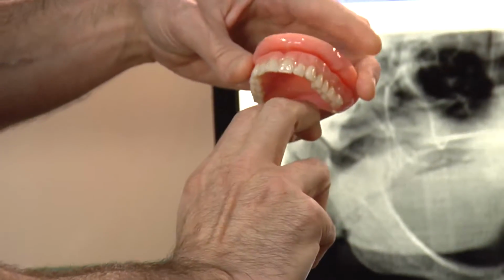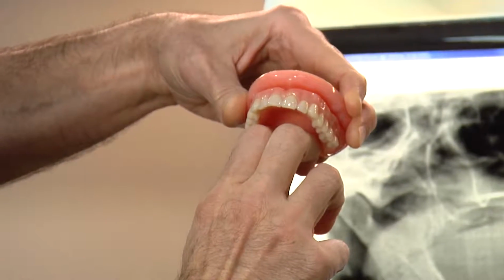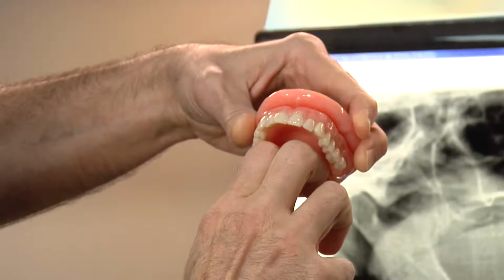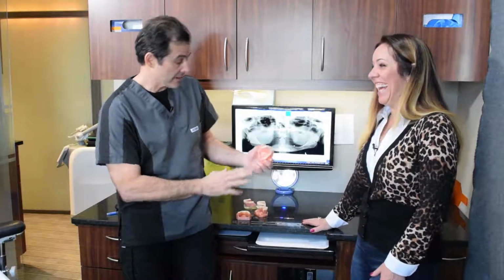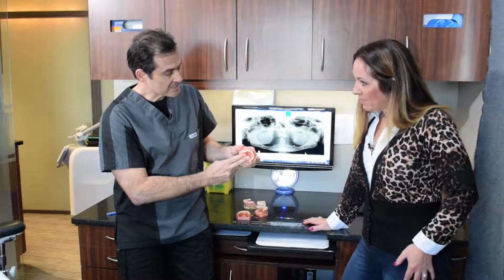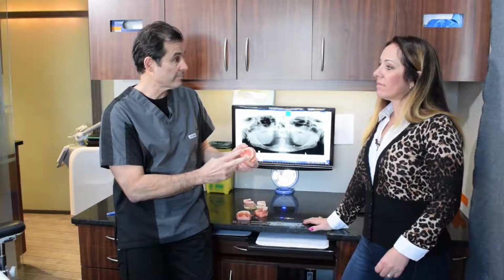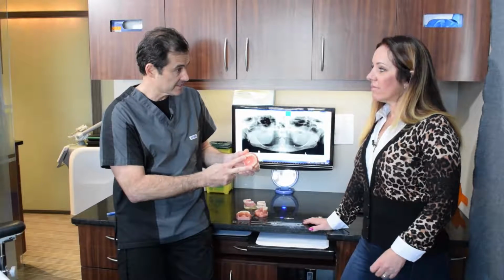So somebody who has a large tongue, their tongue is sitting up against the back of this denture, and that's what allows them to bite into things. So, you may meet the odd person who says, oh, I can eat apples, I can eat corn on the cob with my denture. And you know what's going on there. That's why. It's because their tongue is holding that denture in place. And that's what's happening with those people. Now, most of us probably don't have tongues that are big enough to really hold our denture in place. And so, then we struggle. Oh, okay.